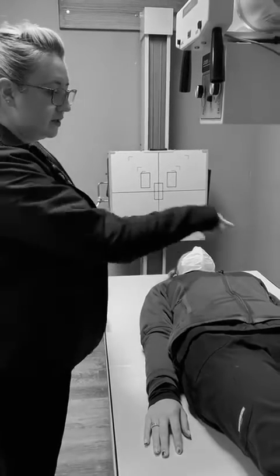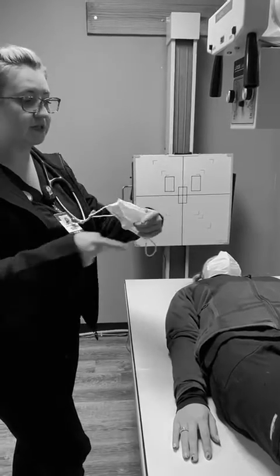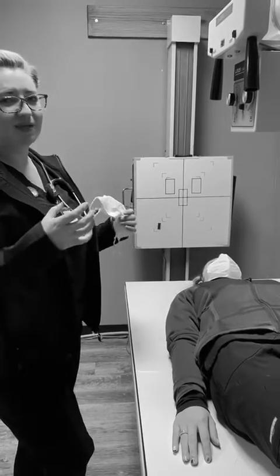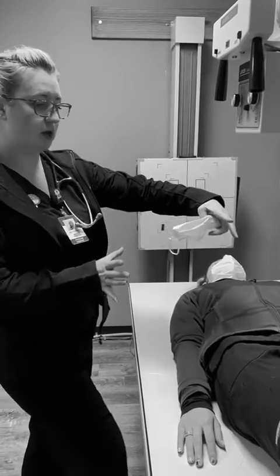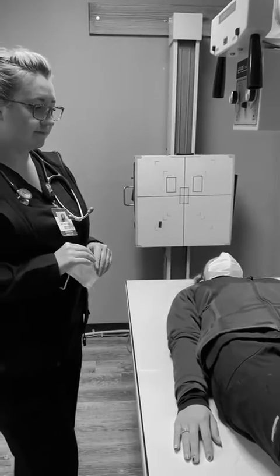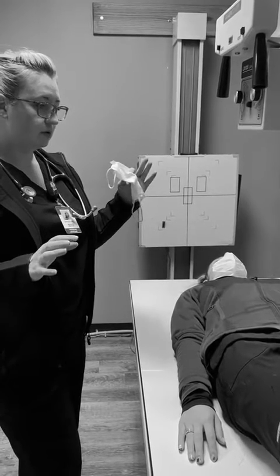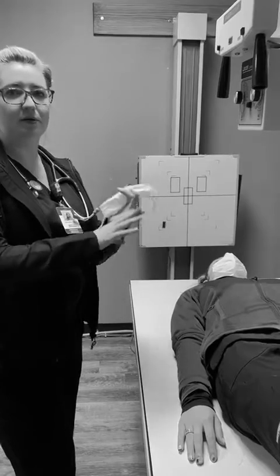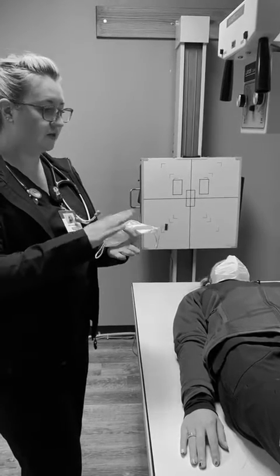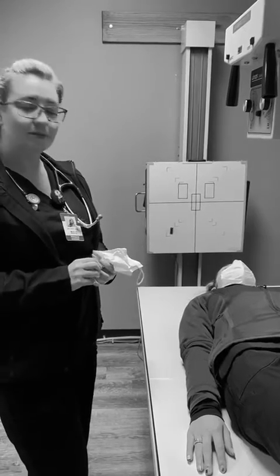You can breathe. It's important to see on the image that you have the pubic symphysis in it. If you're missing it, sometimes you can take a quick little small shot of just the bladder — that should suffice. If you're doing an abdominal series with the chest in it, add a PA chest. And I think that's about it.